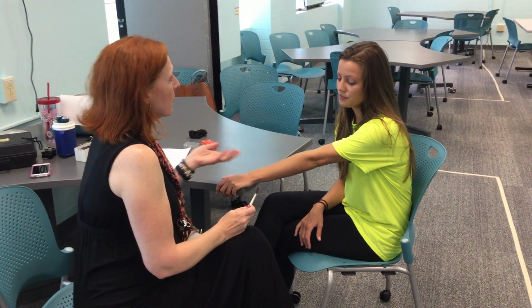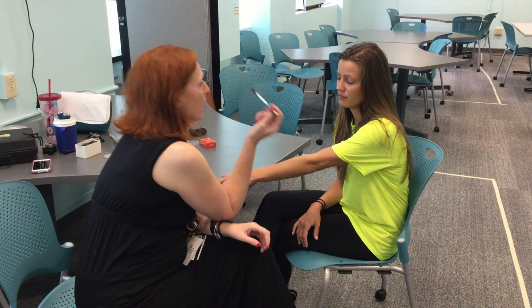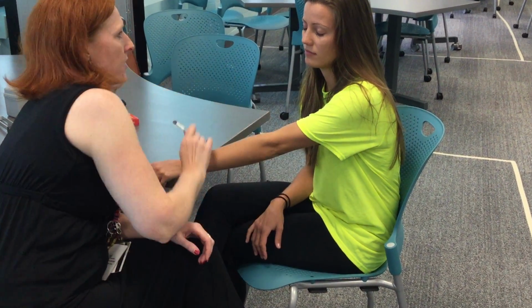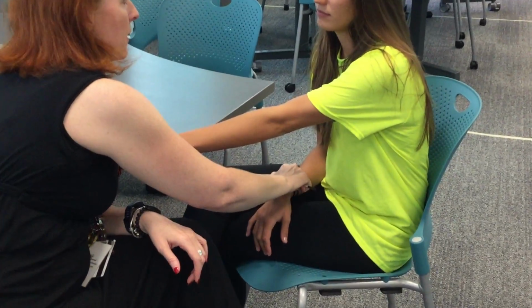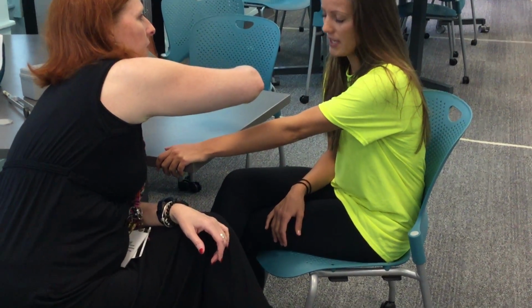So let's say we've done all that and we're just going to now test. So what I'm going to do is I'm going to actually have you shut your eyes, okay? So what you're going to feel is a little brush, okay? So let's say this is the arm that's affected. This would be the arm that's not affected, okay? Do you feel that? Yes. Okay, so we've kind of demonstrated that very quick.